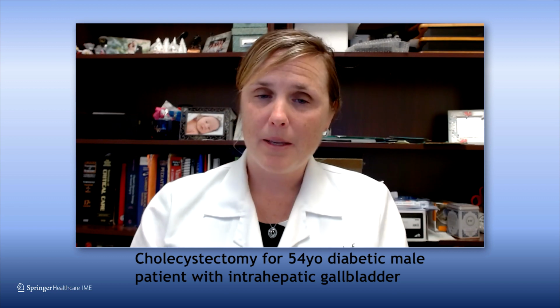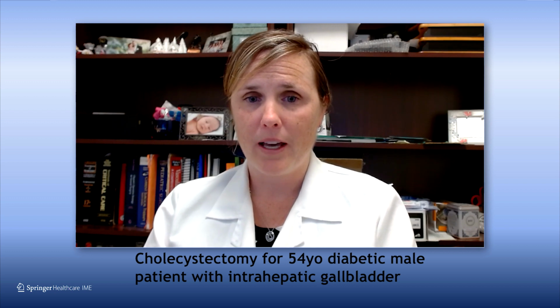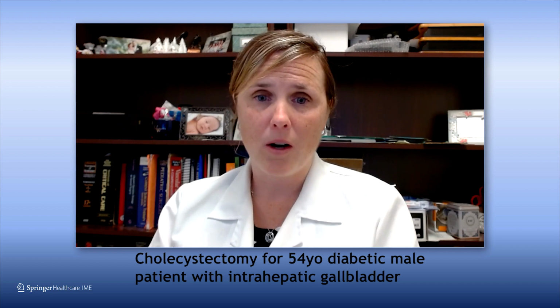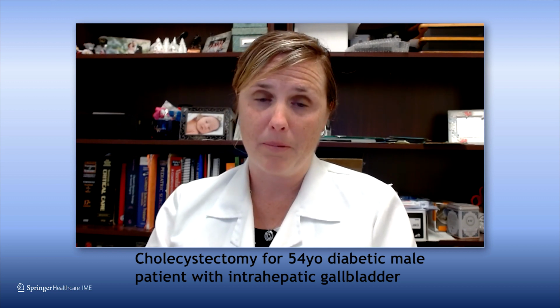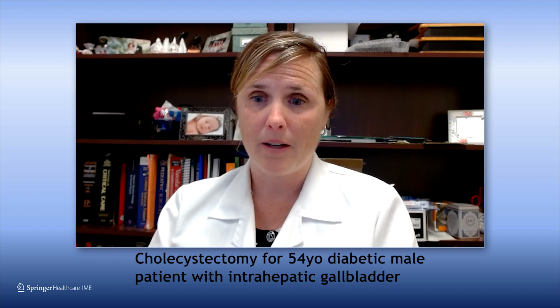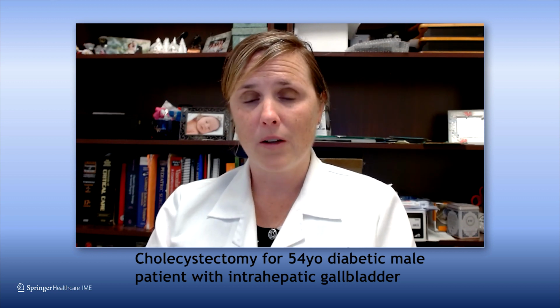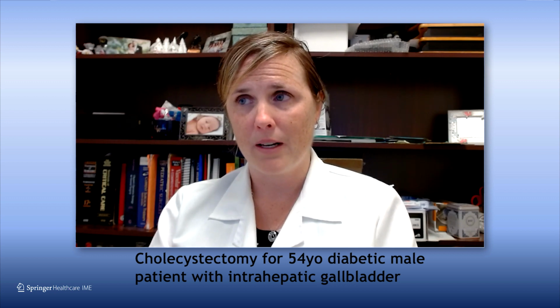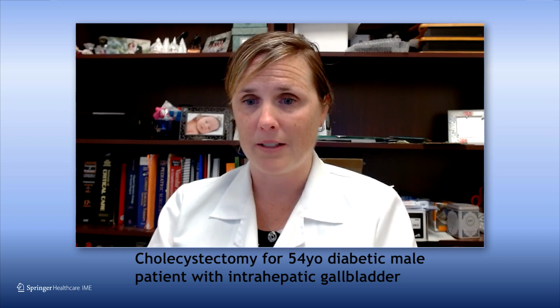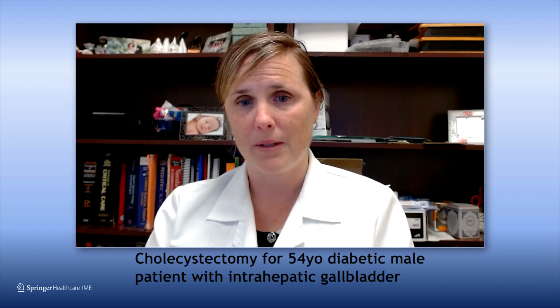And finally, you want to think about what kind of bleeding you have. So just taking out a gallbladder, you're generally going to have pretty mild ooze. But in this case, if you have an intrahepatic gallbladder, you really could have a pretty significant ooze from that liver bed. And you might want to think about a fibrin sealant the way that you would after a hepatectomy. So I think all of those things are important to consider. And there's never really one topical hemostatic agent that is the quote right answer. You kind of have to consider your factors and look at what you see and go with it.